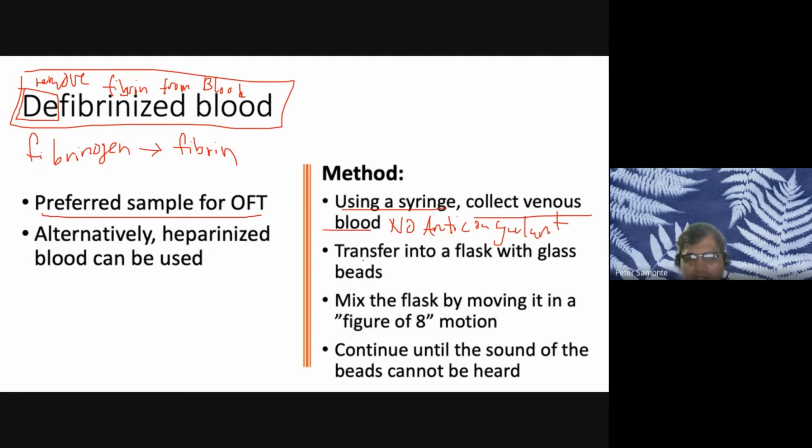Now, you're going to transfer it into a flask with glass beads. Then you're going to mix the flask by moving it in a figure of 8 motion. Continue until the sound of the beads cannot be heard. Plus, it was mentioned here that it has to have glass beads.